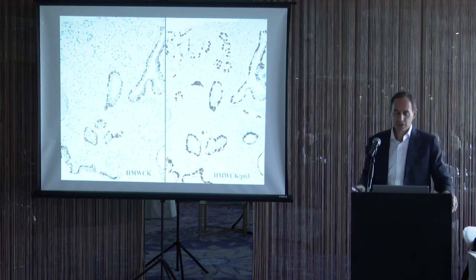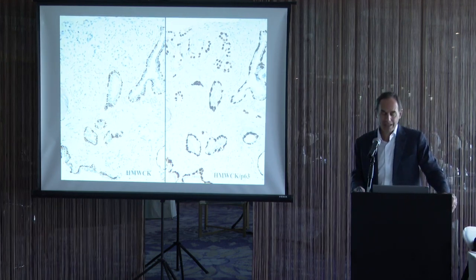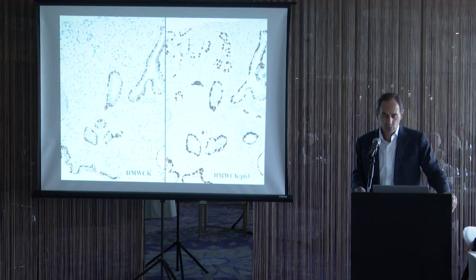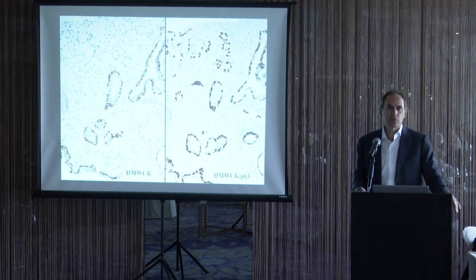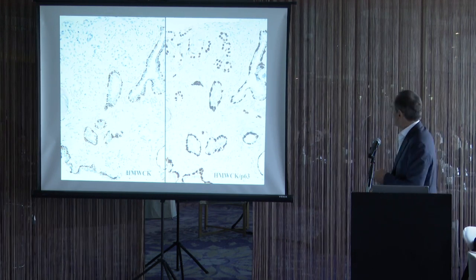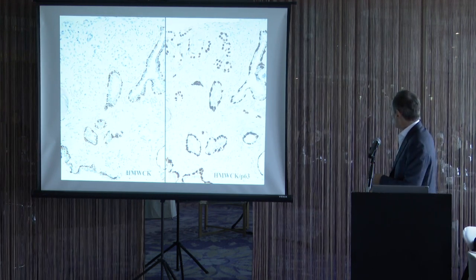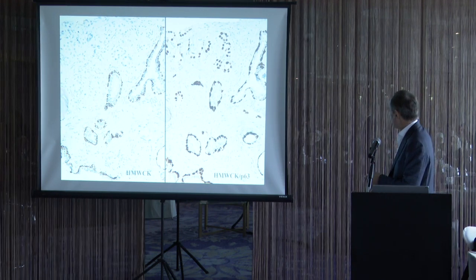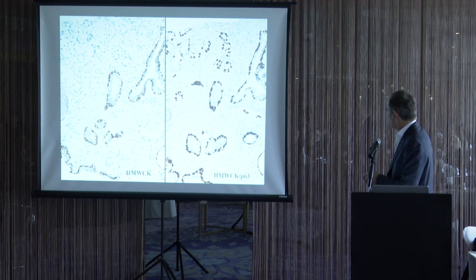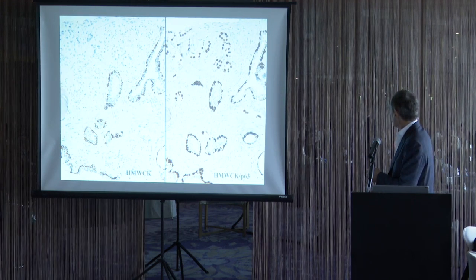There's a variant of prostate cancer that we describe that has aberrant P63 positivity. It's where the cancer diffusely stains with P63. So here we see on the right, there was a cocktail of high molecular weight keratin and P63. If you look at the benign glands, the P63 is staining the nuclei, but you can see there are little tails of cytoplasm for the high molecular weight keratin. So these are all the benign glands.